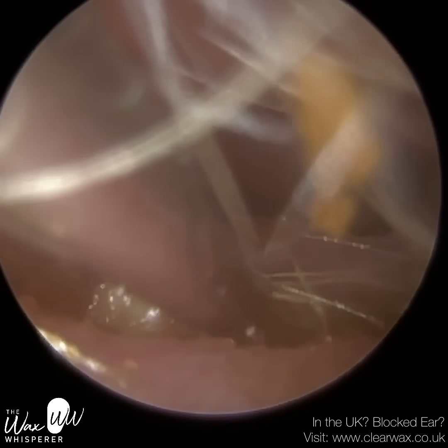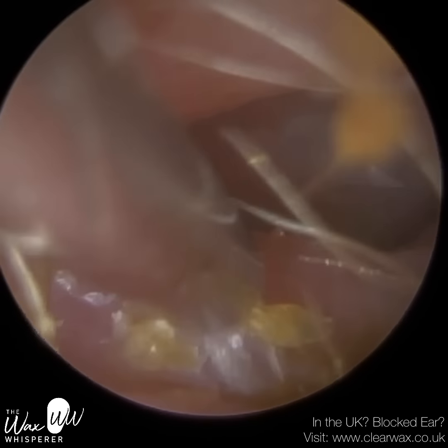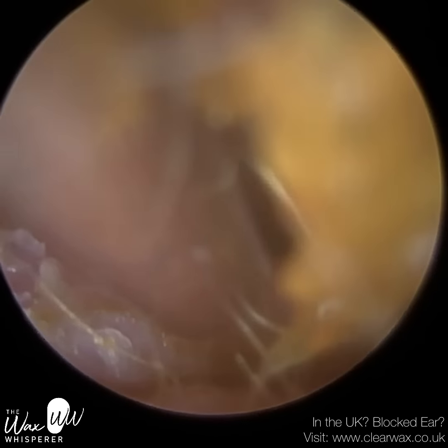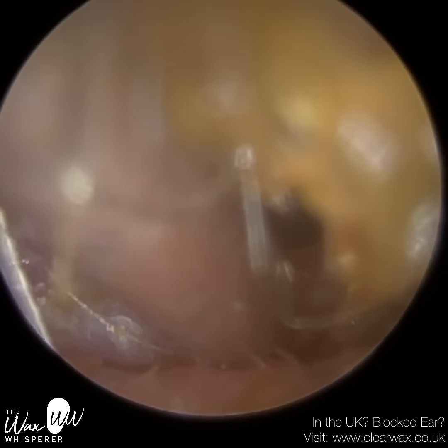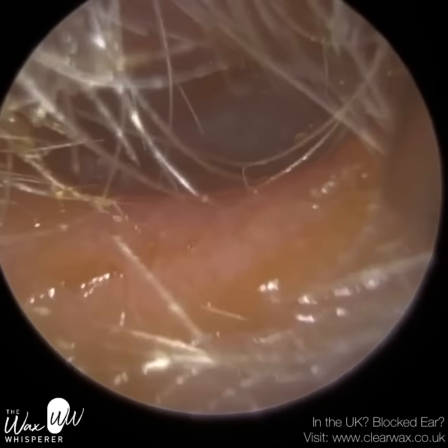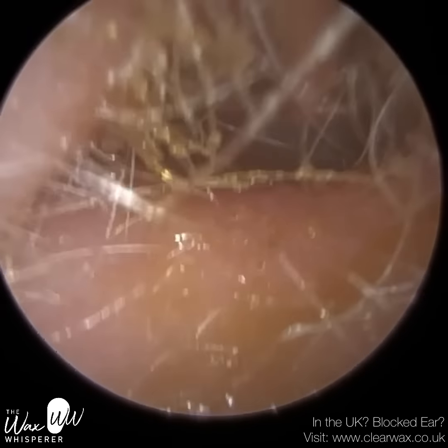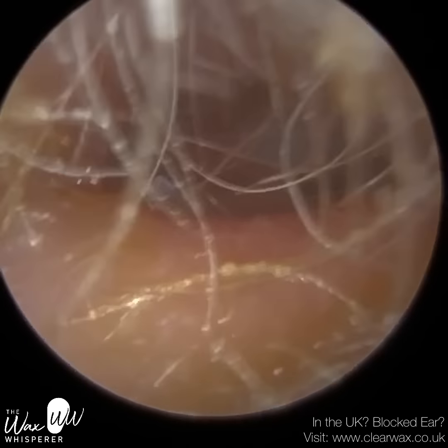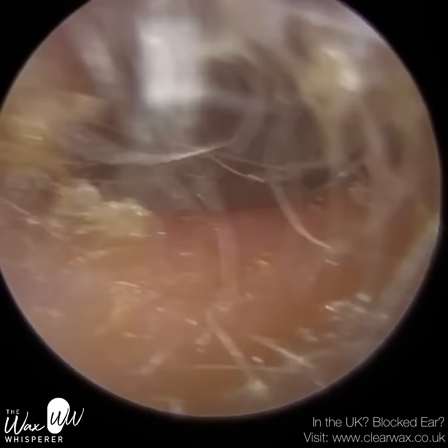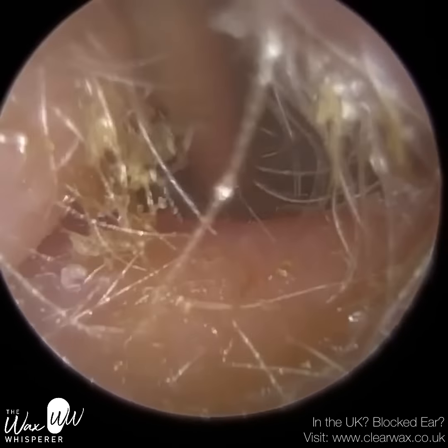So just some dead skin at the entrance here. Again, it's just not migrating out of the ear. And you can probably have an appreciation of how swollen and inflamed the ear canal is. It's very bulged inside and spongy. And it's just near the entrance, you can see all the cilia.